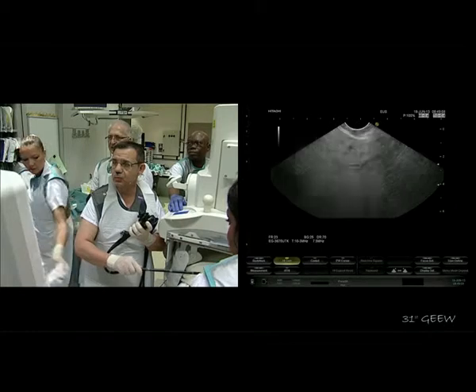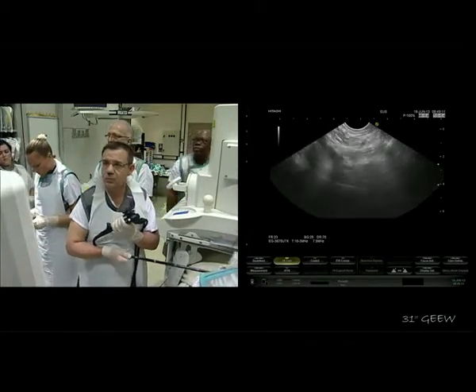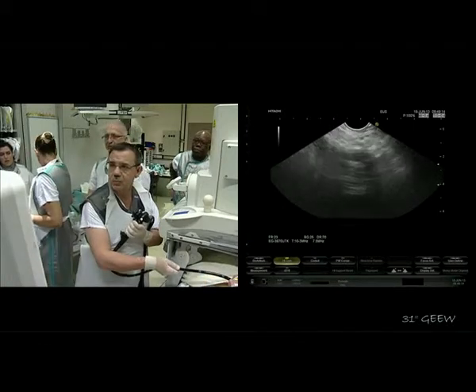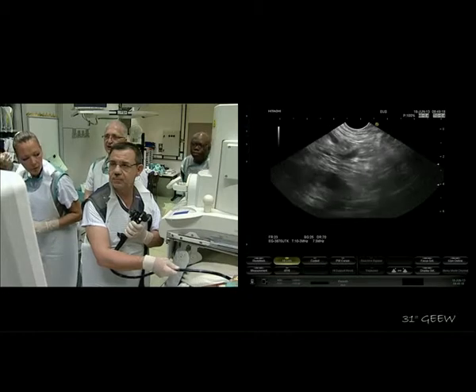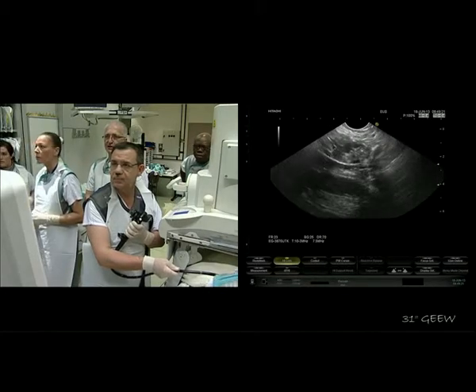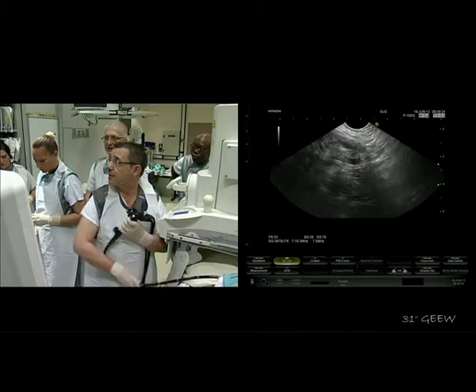I know that there are some of us who are using only a guide wire and then a balloon, but in a severe pancreatitis like this, pushing a balloon just after the puncture with the needle, in my experience, is almost impossible.